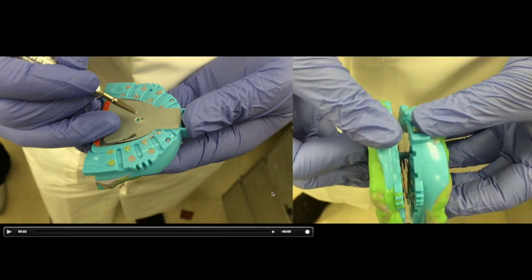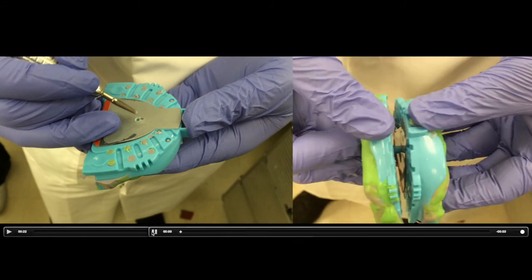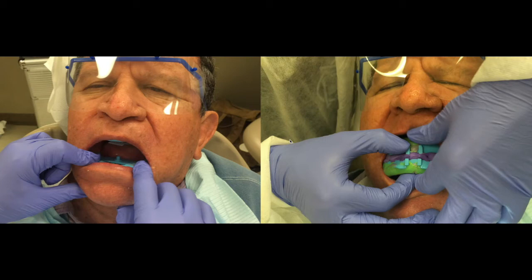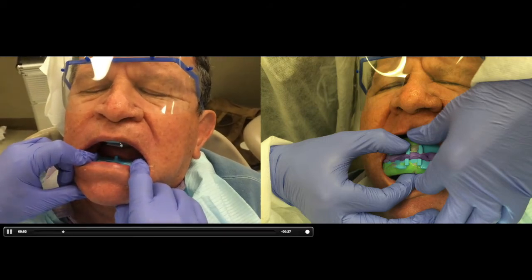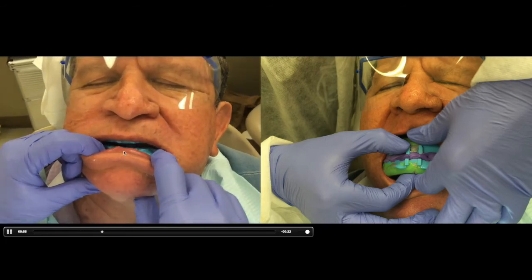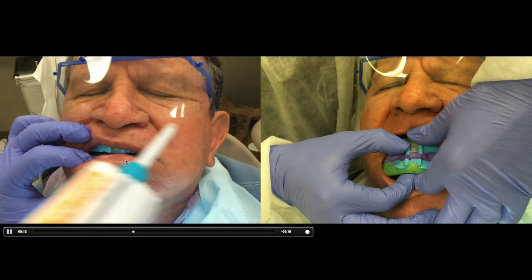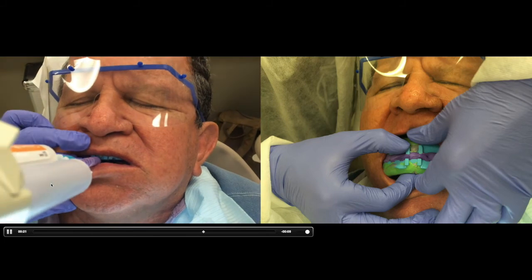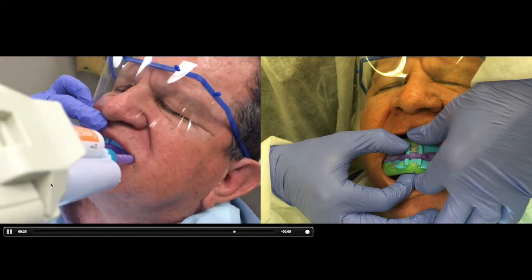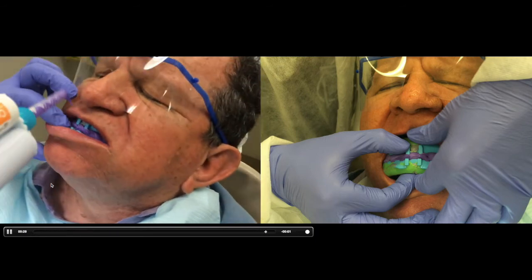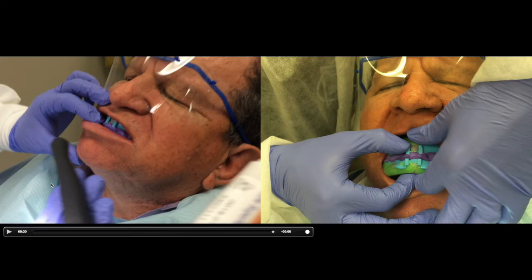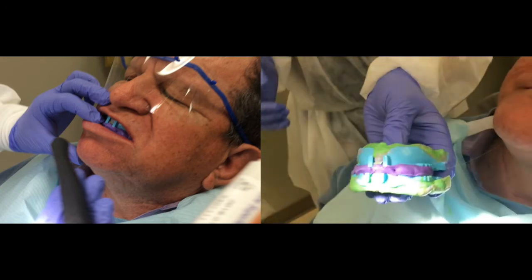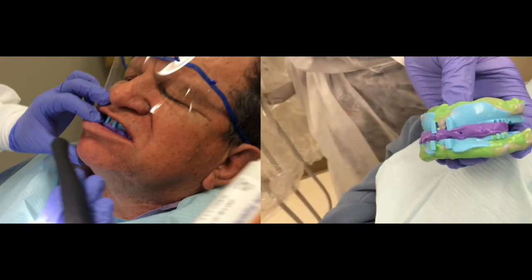Once the one-millimeter depth dimple is drilled on the maxillary plate, intra-orally the pin will stay in the CR position instead of sliding — it is now locked into the CR position. Then we use PVS fast-setting bite registration to fill the gap between the maxillary and mandibular tray. After waiting for the bite registration to set and removing the tray and maxillary-mandibular device, that is how you register centric relation.